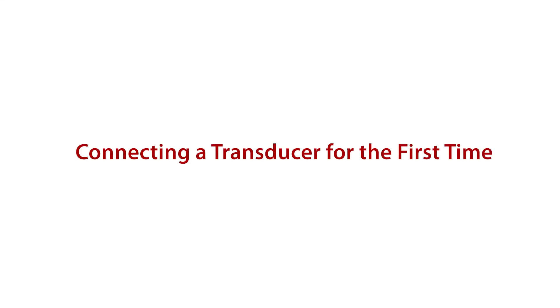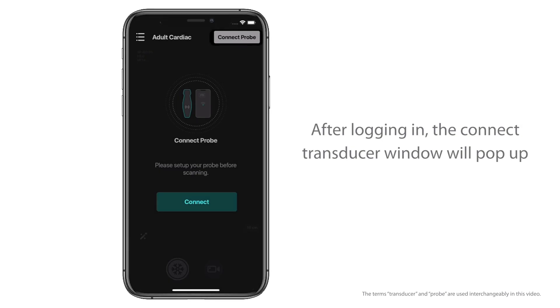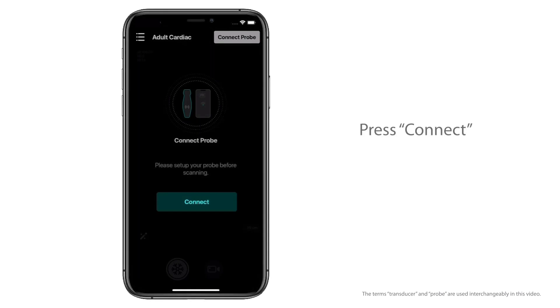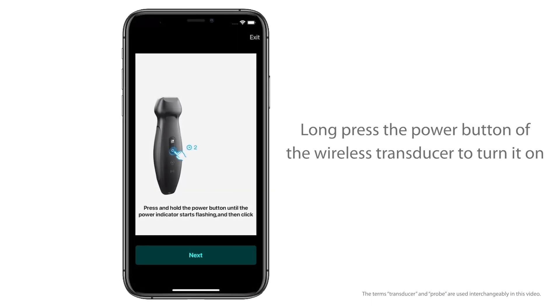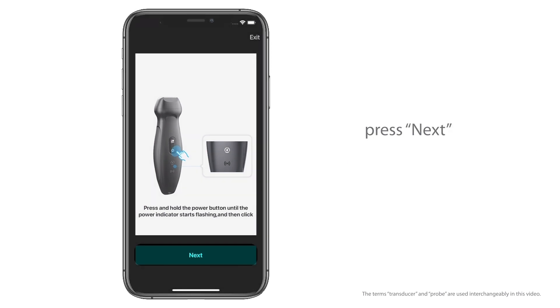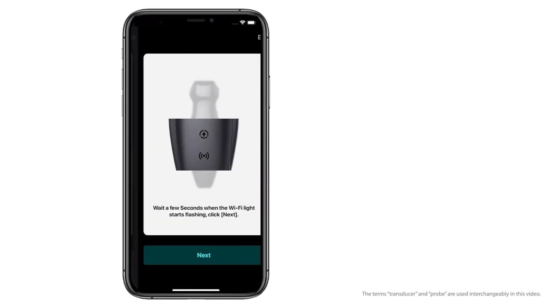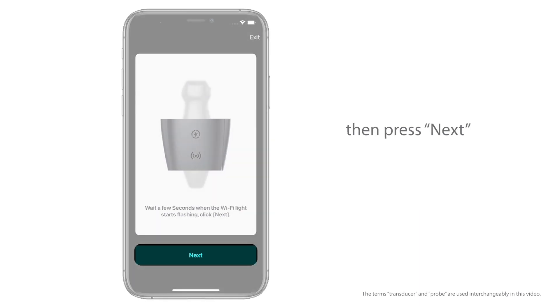Connecting a transducer for the first time: After logging in, the Connect Transducer window will pop up. Press Connect, then long press the power button of the wireless transducer to turn it on. When the power indicator starts flashing, press Next. Wait a few seconds until the Wi-Fi indicator starts flashing, then press Next.